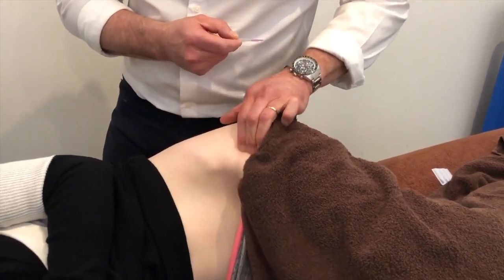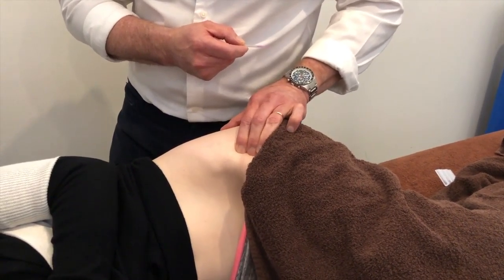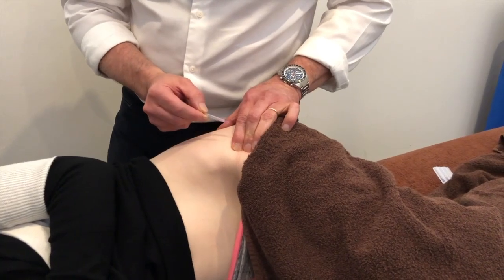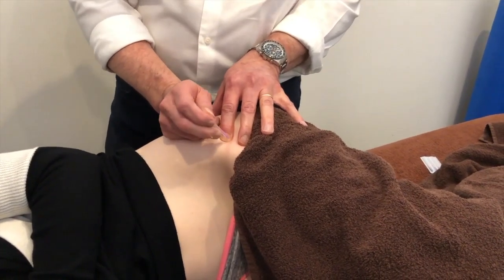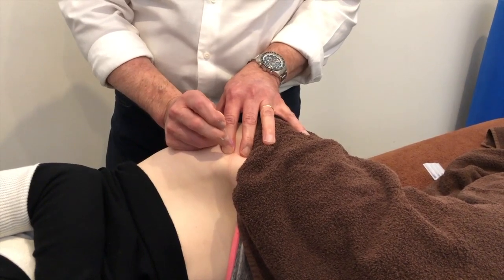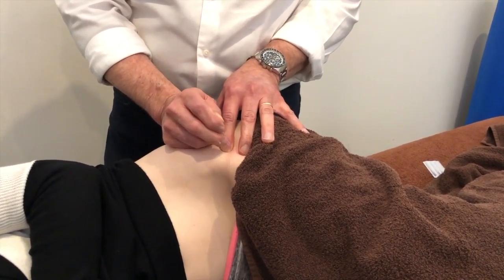What we need to do is keep our fingers together and palpate as a group, okay, like this. So there's my spot right there. Now we're going to spread and we're going to move that finger away from this one. So what we do is we spread like that. And what that does here is there's no bulge here, so you're actually closer to the muscle tissue. And you stretch the skin. So when I tap that needle in between these 2 fingers, the needle will stay in situ and not touch your glove.